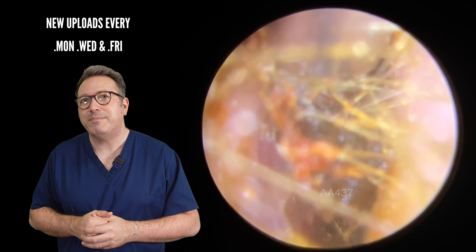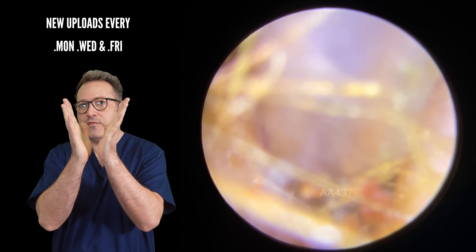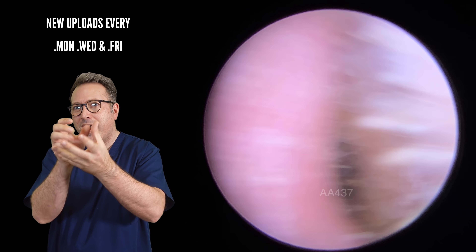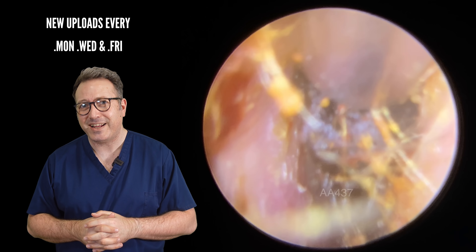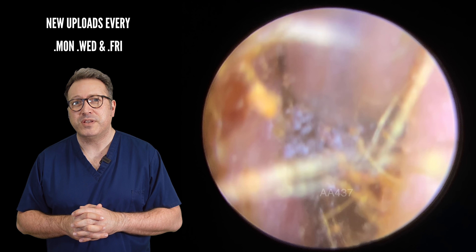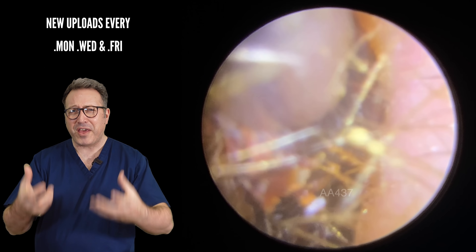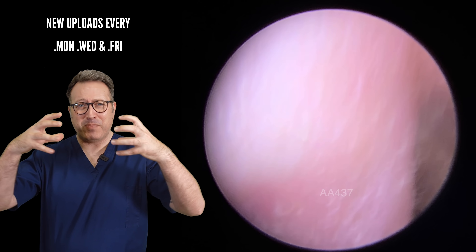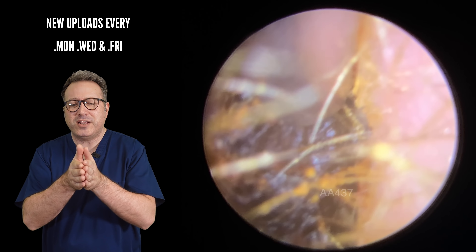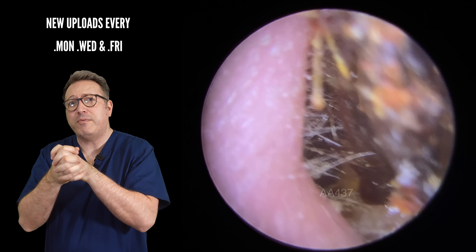We're starting to see a little bit of movement — it's starting to come through the gap. Depending on how wide the ear canal is on the other side of that V-shaped valley, if it's much wider on the other side, it's going to be more difficult to pull this through. So we have to kind of turn the wax, break a bit off, turn it again, break a bit off to get it through — which is exactly what we're having to do. Really, really struggling to get this top section through. You can see a lot of hair embedded in there — this thick clay-type wax with hairs embedded through the middle binding it all together, formed into the shape of the canal. Imagine a letter T — a narrow section that widens out at the top. You're trying to get that wider section through that narrow gap — and out it pops.